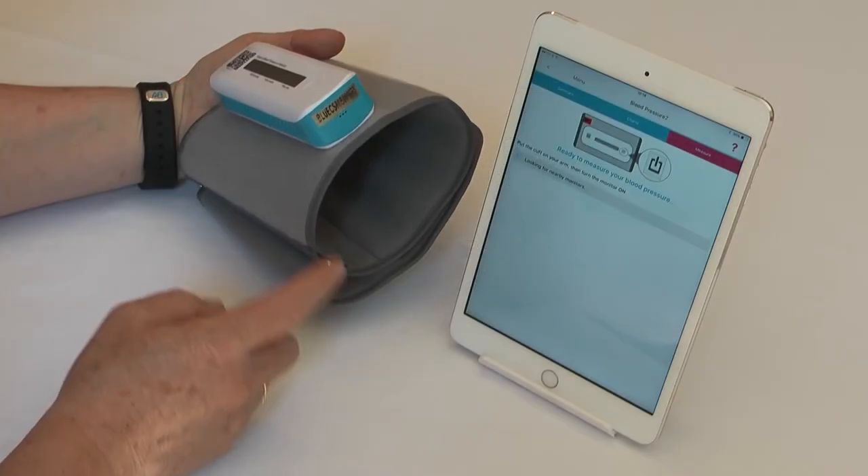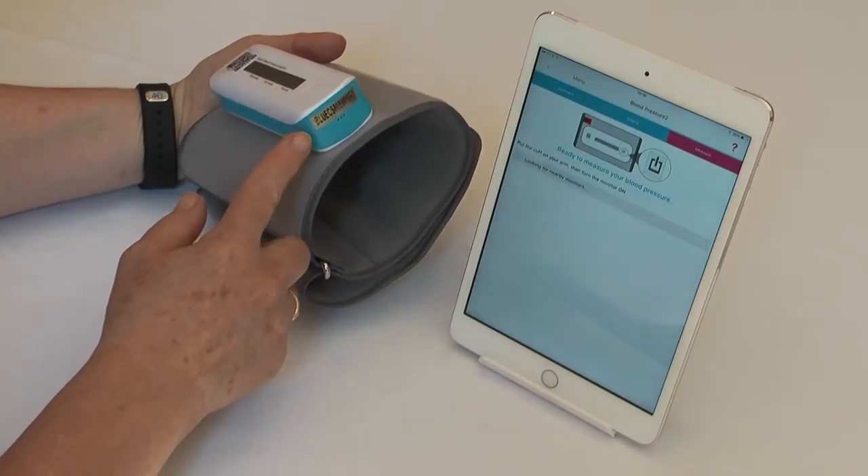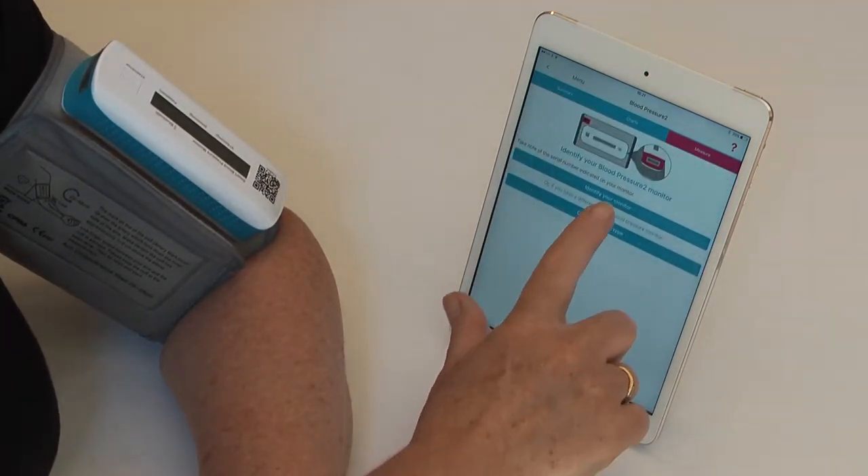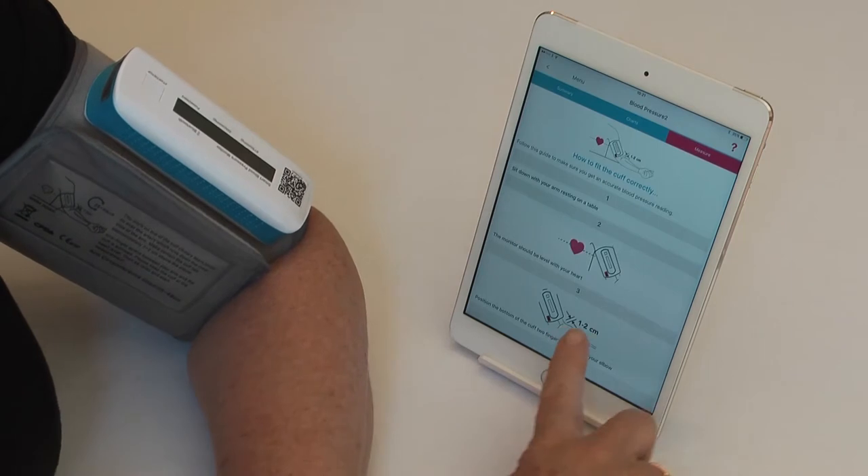You will find the serial number at one of the ends — take a note of that. Then upload your device; you cannot do it by the barcode. Then identify your monitor.